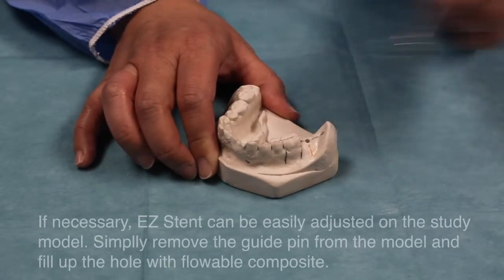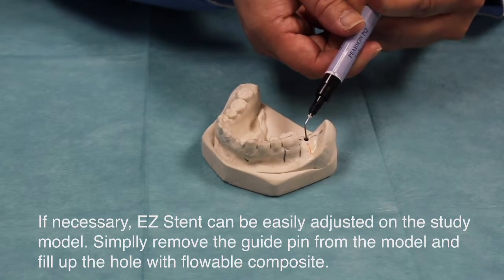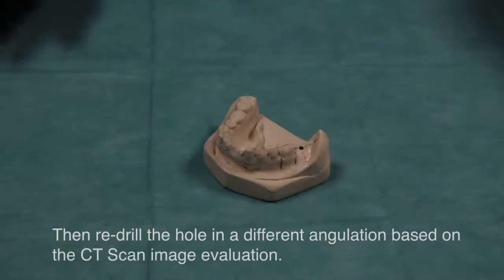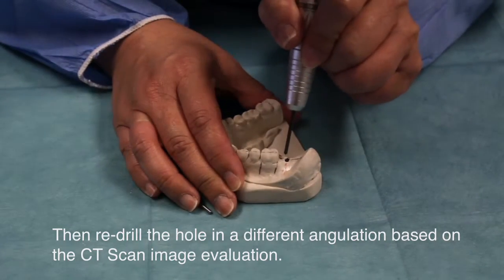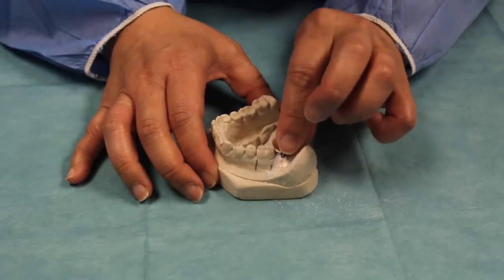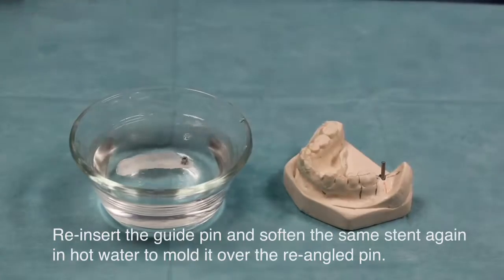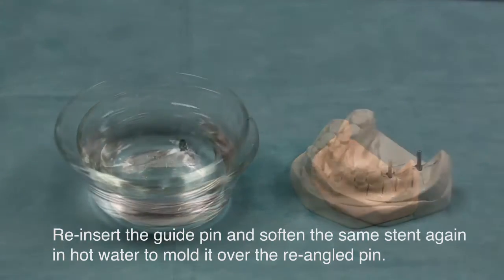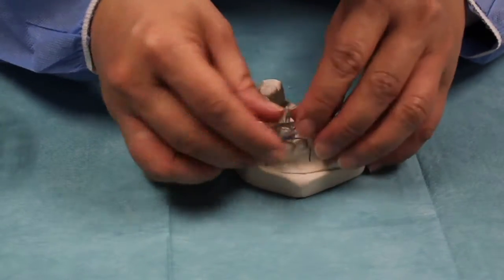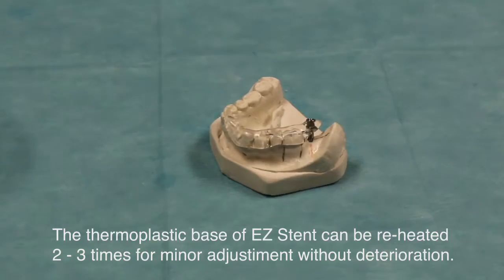If necessary, EasyStent can easily be adjusted on the study model. Simply remove the guide pin from the model and fill up the hole with flowable composite. Then redrill the hole in a different angulation based on the CT scan image evaluation. Re-insert the guide pin and soften the same stent again in hot water to mold it into the re-angled pin. The thermoplastic base of the EasyStent can be reheated 2-3 times for minor adjustments without deterioration.